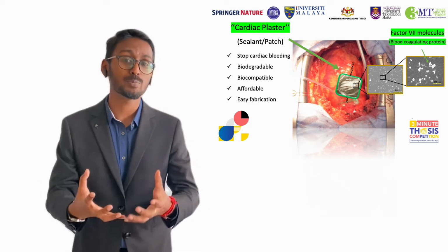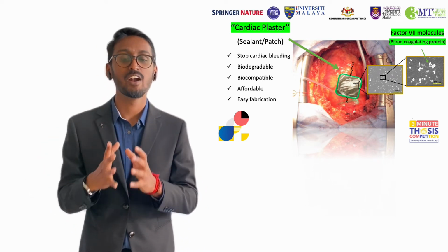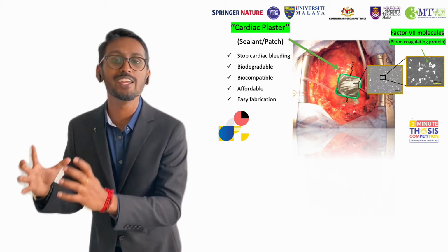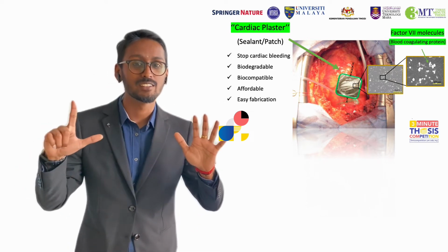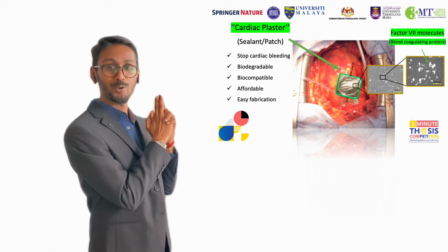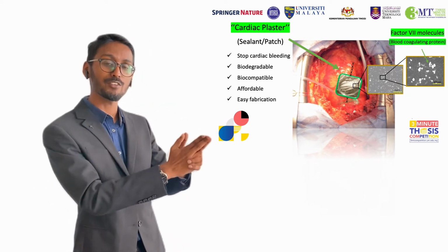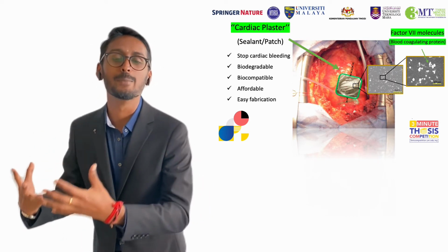So to address this problem, this membrane will be attached on the heart surface as a sealant right after the surgery, as shown here. But we need an agent to stop the bleeding, and for that comes our rescuer called Factor 7. Now be clear, it's called Factor 7, not James Bond 007. But dare I say, both of them have something in common: Agent 007 saved our life from terrorism, and this Factor 7 saved our life from bleeding.